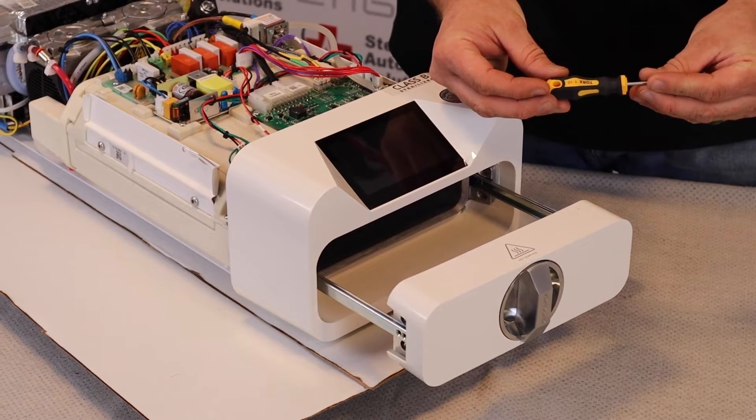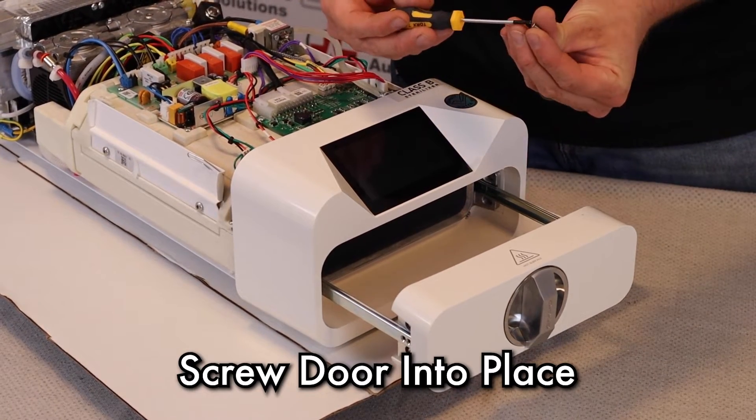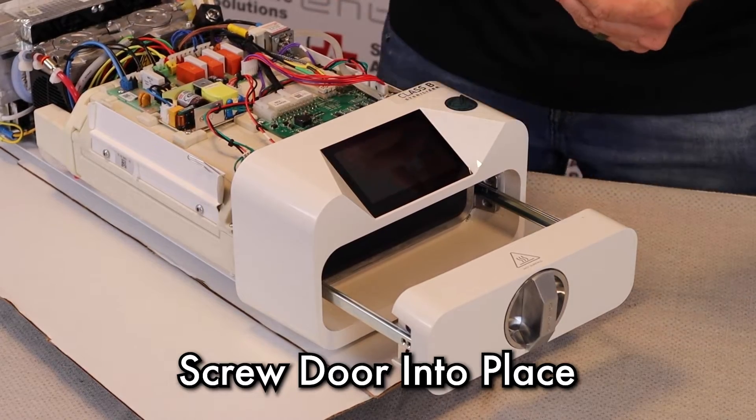Using a Torx T10, we're going to reinstall the four screws that hold this door in place.